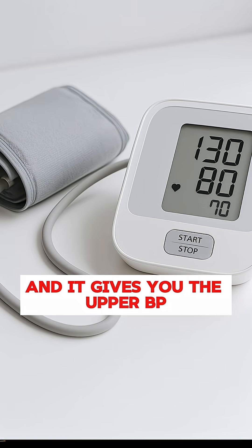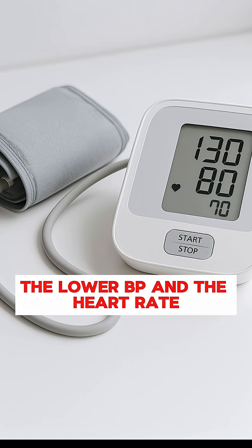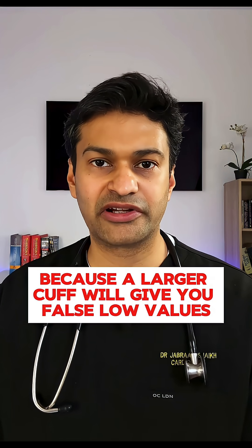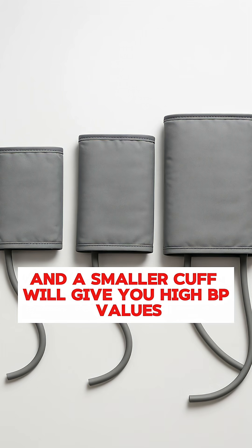You just have to press a button and it gives you the upper BP, the lower BP, and the heart rate. You need to be careful about the cuff size, because a larger cuff will give you false low values and a smaller cuff will give you high BP values.